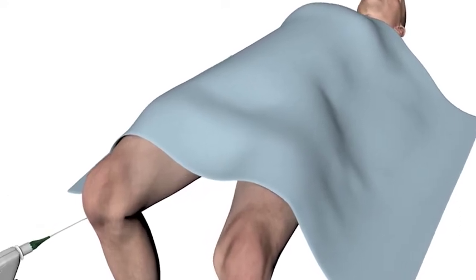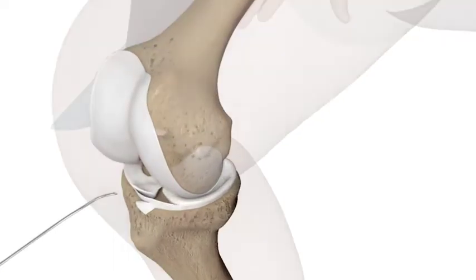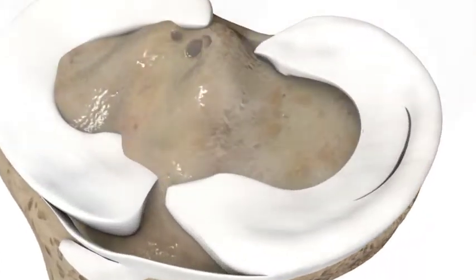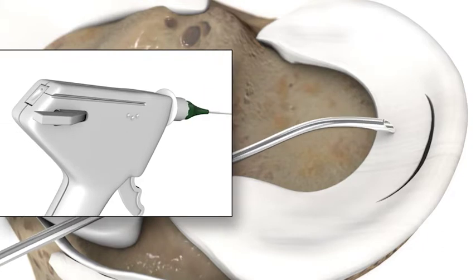The Sharpshooter is a system designed for inside-out meniscal repair that allows for simple and easy-to-use needle advancement. Insert the green cannula attached to the Sharpshooter handle into the joint space.